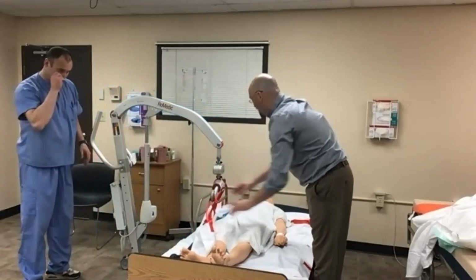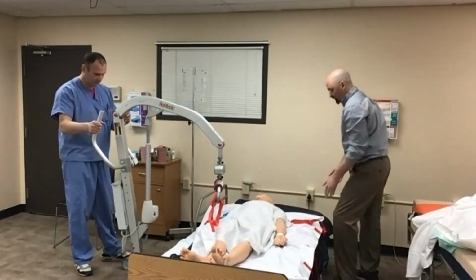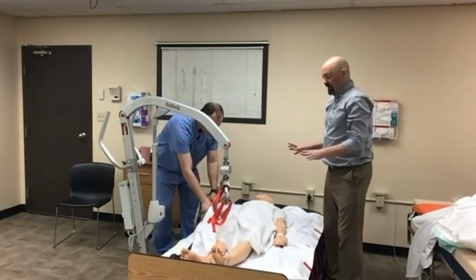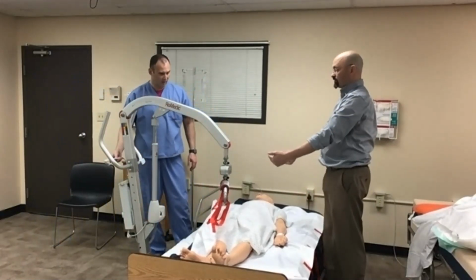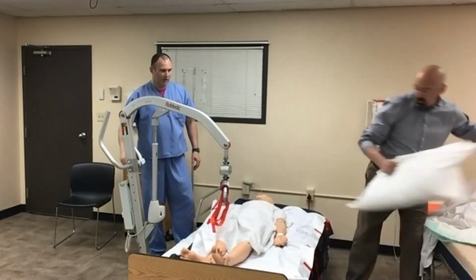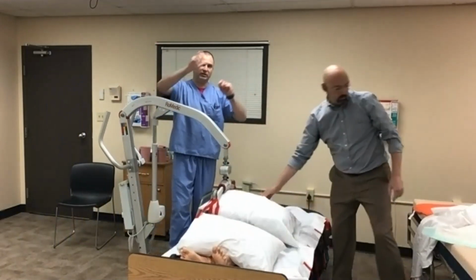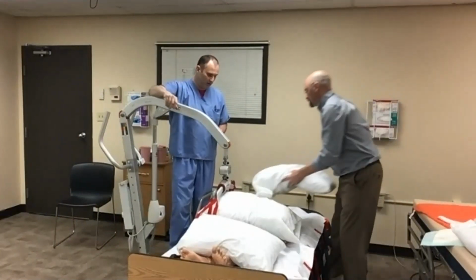Now, if you also notice, we did not connect the head. As we go, somebody's going to be managing and controlling that airway here. So we're going to slowly lift and slowly slide that patient across. Your ceiling lift or floor lift is going to be doing all the turning, and we're going to slide into position. We're going to have our pillows ready, and hopefully you have an XY track so that you can freely move that lift as you need to while you're lifting.